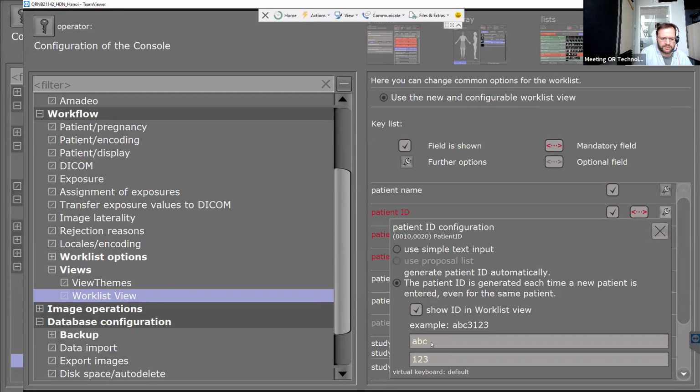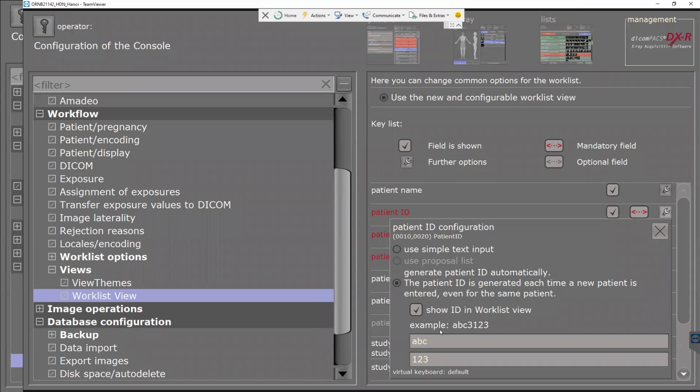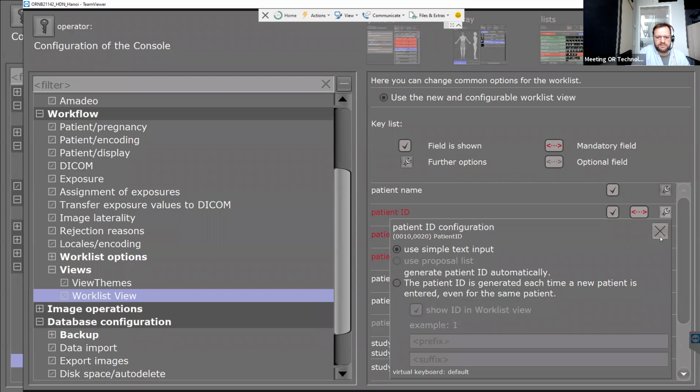And the work list ABC. I will write this question down. I will talk to our development, and I will revert to you with the answer by mail. Is this okay? Yeah. I think it's important. Okay, I have noted down this question, so let's check it back to simple.